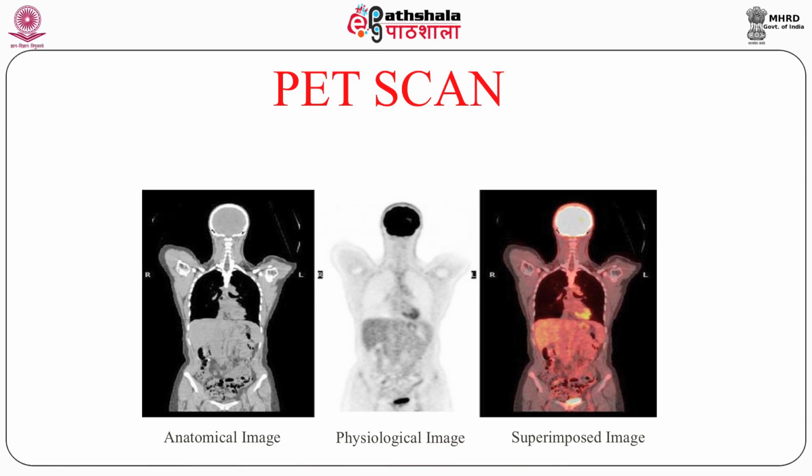Now, the first image is the one found as an anatomical image. Where has this anatomical image come from? It has come from the CT part.